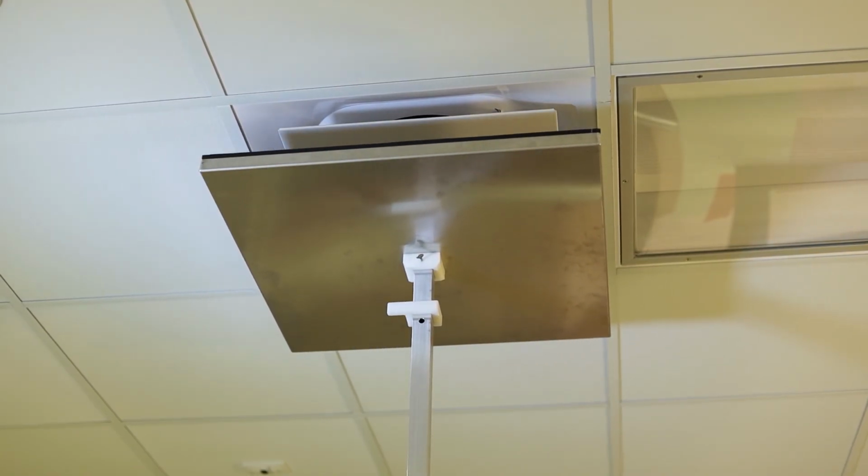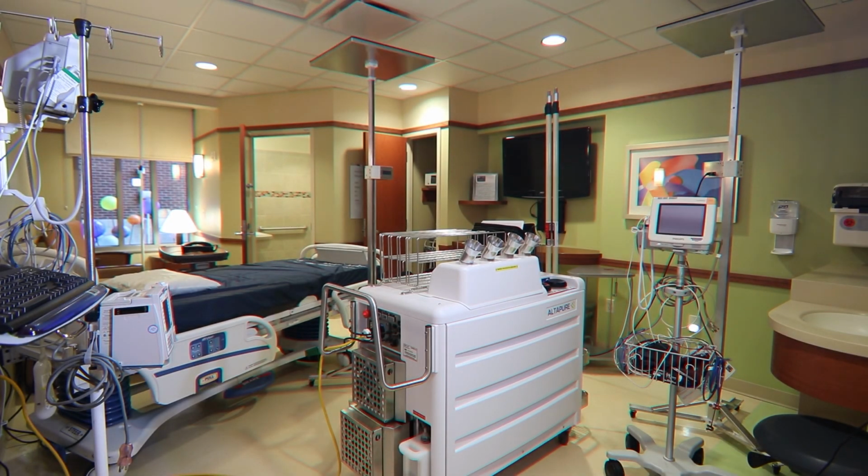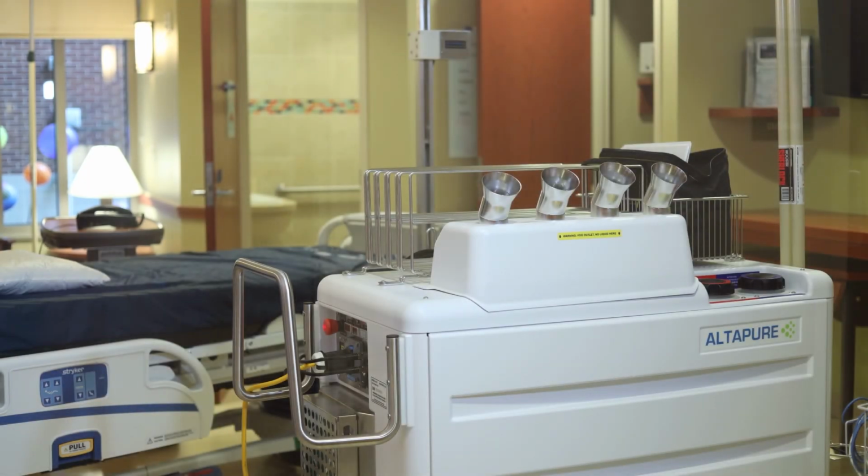The automatic vent cover tripods are plugged into the machine and will come down about 6 inches halfway through the dehumidification process. This utilizes the room's HVAC system to get the space back to ambient humidity. As such, there should be nothing blocking the path of the vent covers once they are set up.